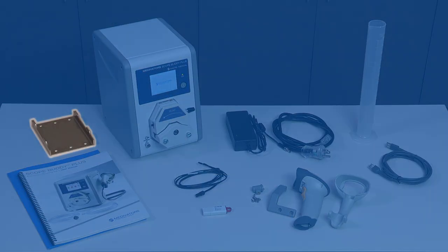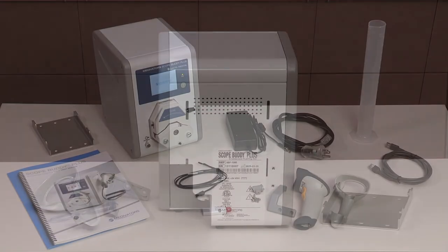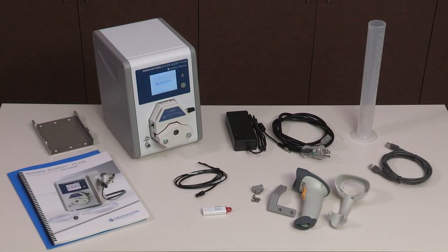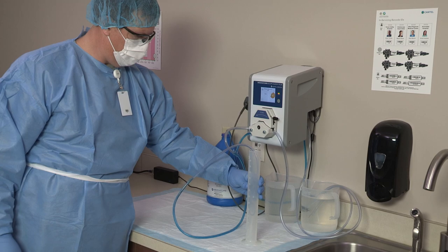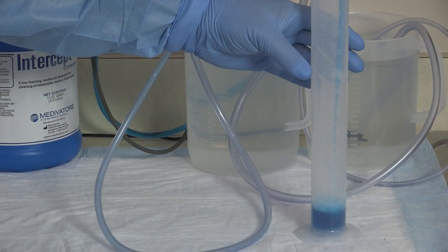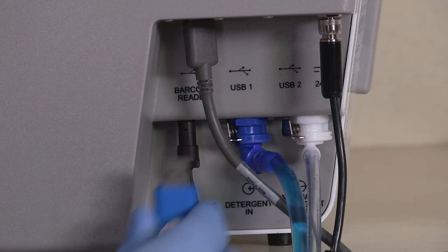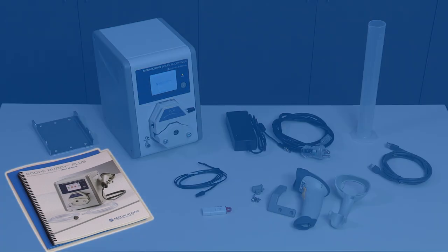A mounting bracket provides an option to mount the unit in order to save counter space. A medical-grade, six-foot power cord and power supply are included — only use the power cord and power supply included with the unit. A 250-milliliter graduated cylinder is included to perform the daily dosing verification procedure. Also included is a USB drive containing the Scope Buddy Plus Flushing Aid software for the reporting feature, and the user manual and in-service packet.